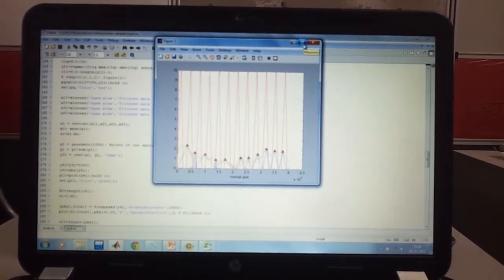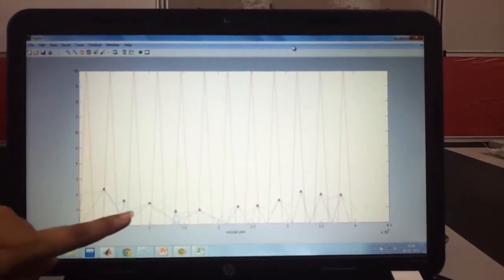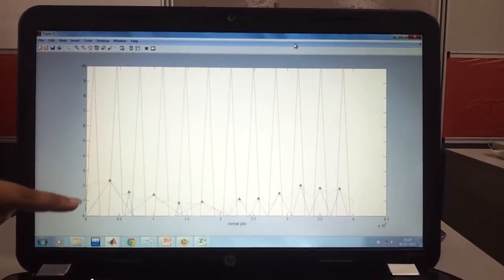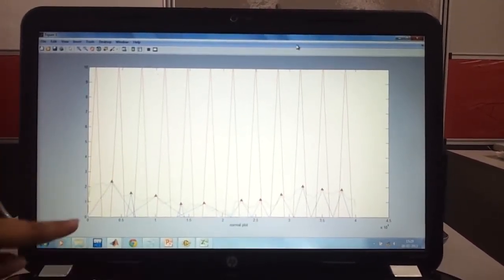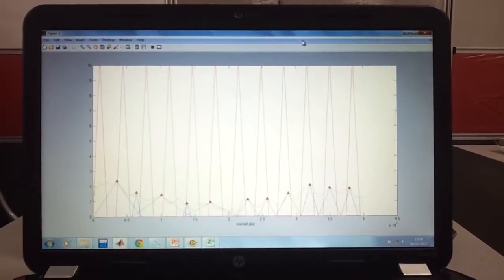Here the red triangles signify the movement of the ball, whereas the other triangles are the maxima. These are the slope of the movement of the person, and they have to coincide with the movement of the red ball. This is how these two disorders are being detected. Thank you.